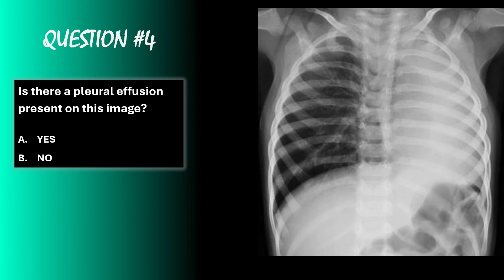Last question: is there a pleural effusion present on this image? Yes — there is a large pleural effusion in this patient's left chest, causing opacification of the entire lung field.